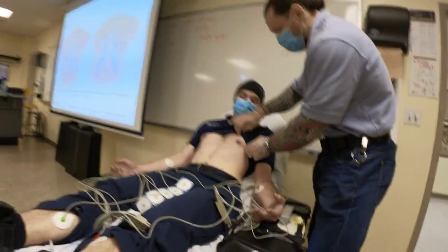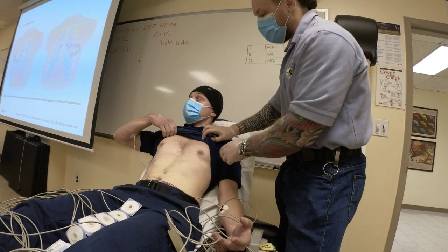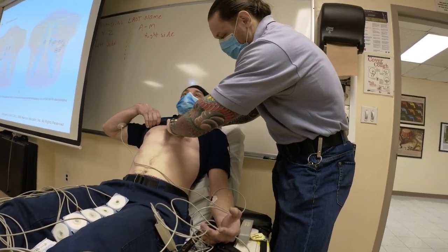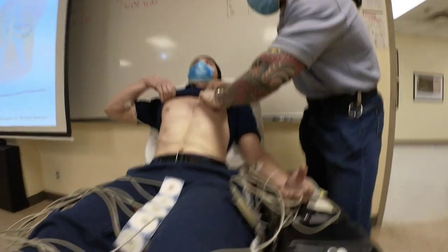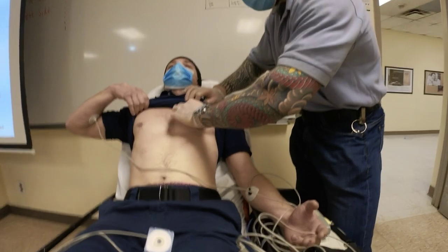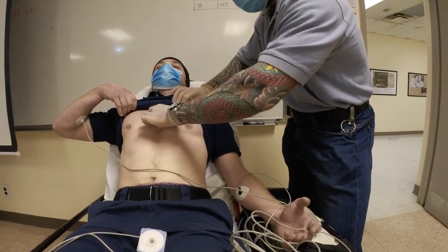The next thing, you notice I'm not putting it based on what? On the diagram. I'm going to go based on what? The landmarks. So I find his manubrium, and it corresponds to the second intercostal space, right? I'm going to go down third, and then fourth. Fourth intercostal space.